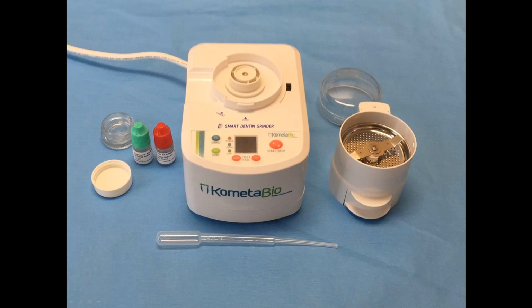So we go ahead and we place some of the teeth into the grinder, and we start to particulate the graft. This is what it looks like before it's ground. Now we're going to take 3 more teeth and place those into the grinder, but don't overload it. So usually I go 3 to 4 teeth at a time. Here, whether it's granulation or restoration, you can see we've cleaned that quite well. We'll put those into the grinder as well. Grind for 3 seconds and then sort for about 20 seconds.